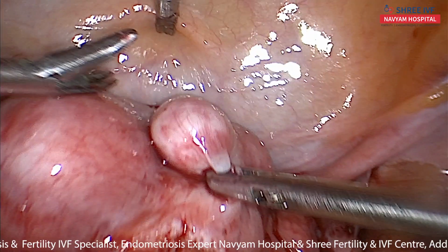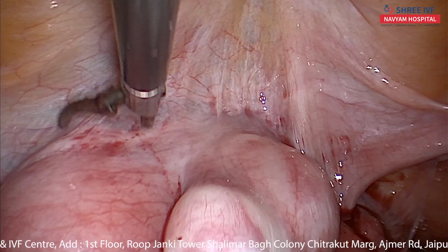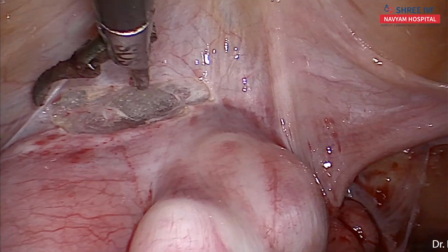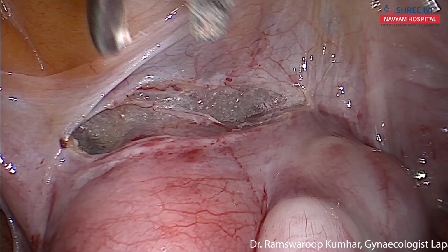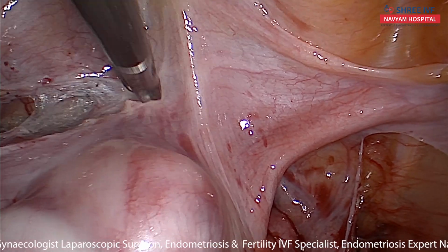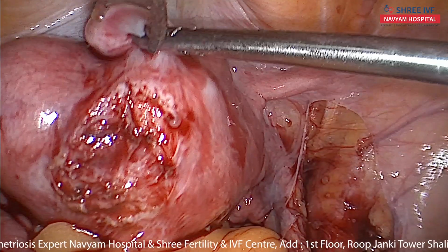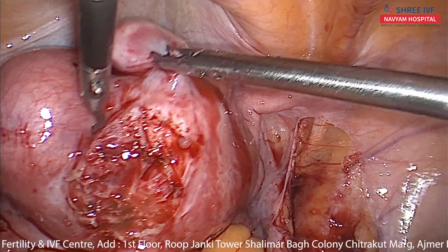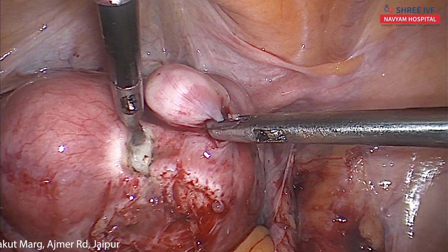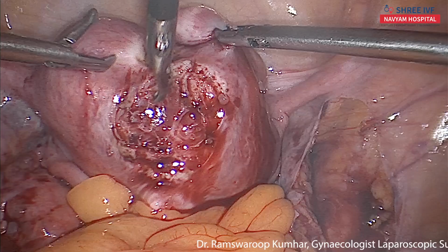So we have to dissect a slight amount of bladder so that we can easily enucleate these lower myomas without damaging the bladder. Okay, this is fine. This is the myoma, this is the myoma, and we will give the midline incision. And we'll try to remove all the myomas from this incision.